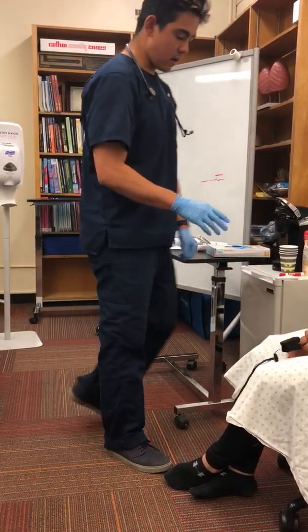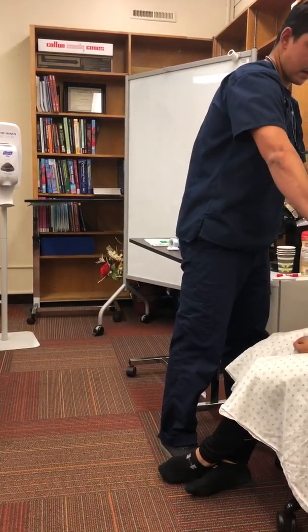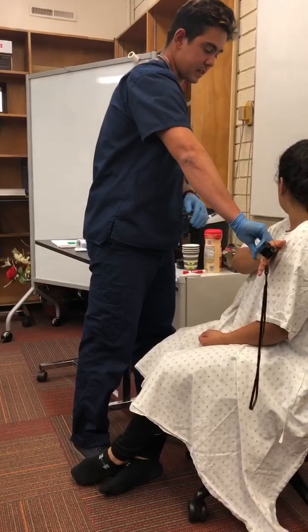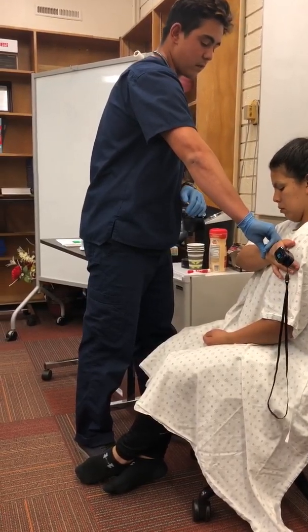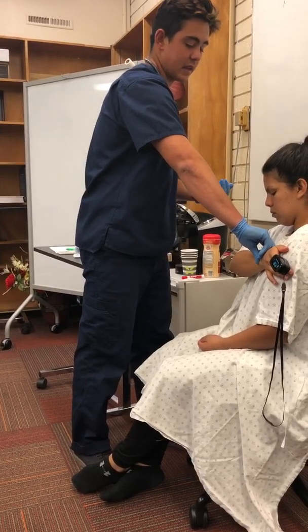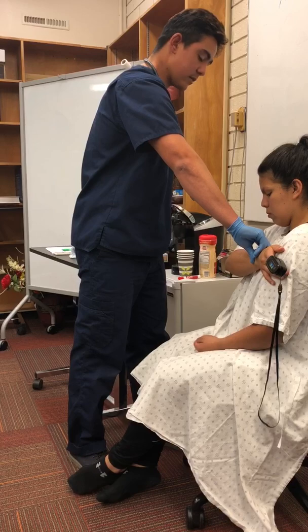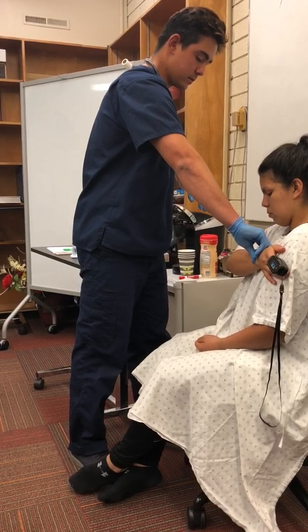Okay, so we're going to let that go. I'm going to go ahead and take your pulse for a minute. This is just albuterol, but if it were a corticosteroid or anything similar, we can have the patient rinse their mouth to avoid any thrush or infections, but it is not. So again, we're going to be doing the 1 minute of your pulse.